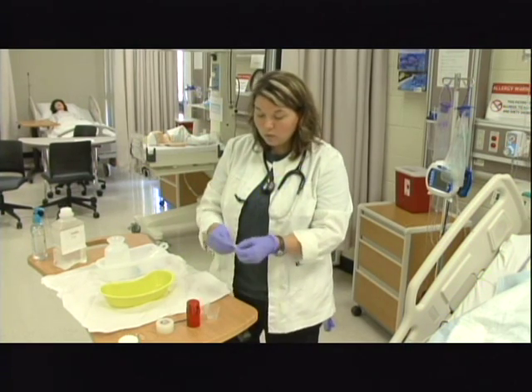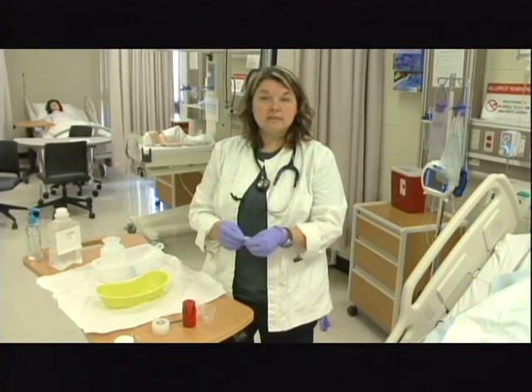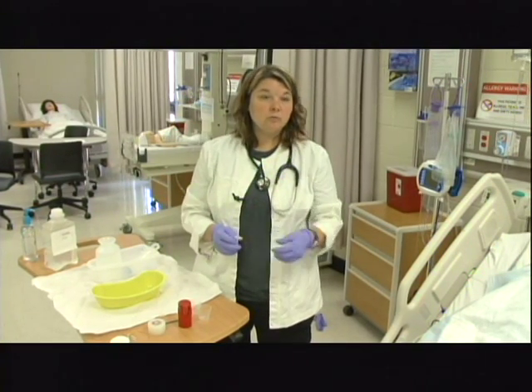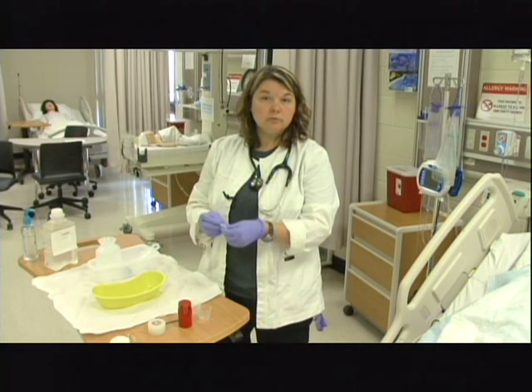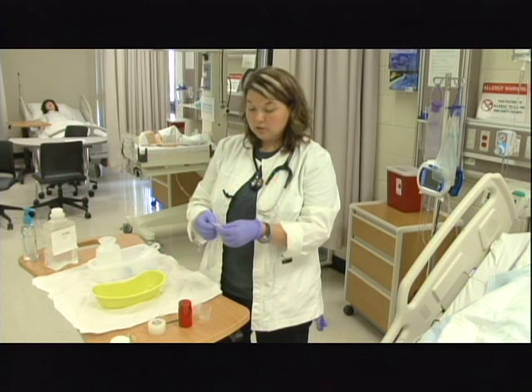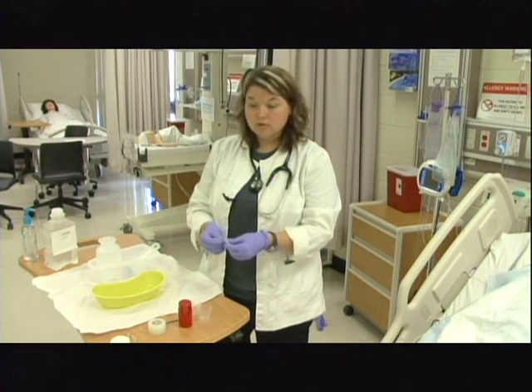But we're going to say that he has several pills ordered here, and of course we would perform the 6 rights of medication administration, where we would verify the right patient, the right medication, the right dose, the right route, the right time, the right documentation, go through all of those things. You also need to check your medications for expiration and all of those things.